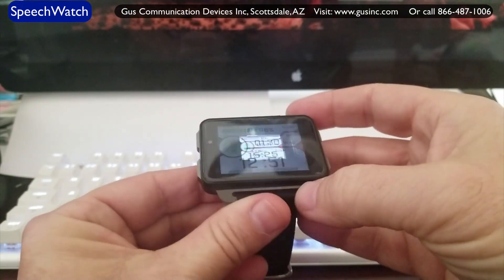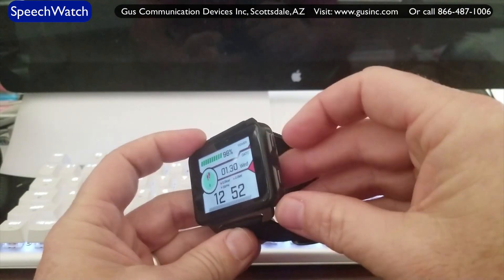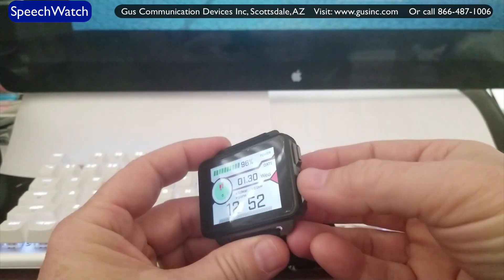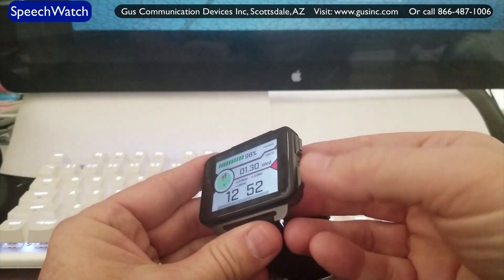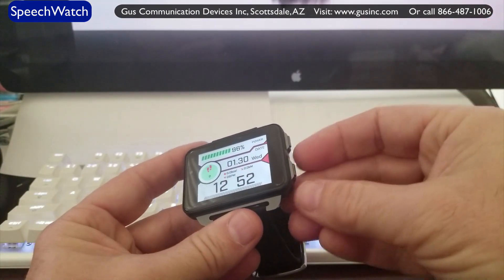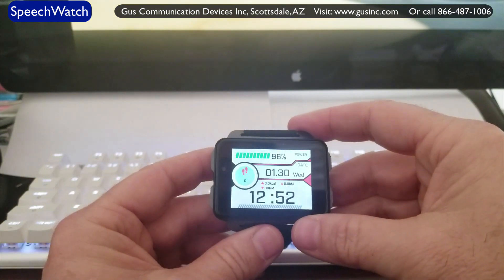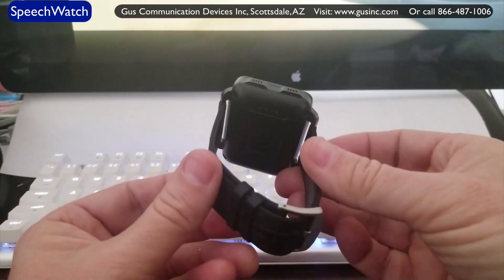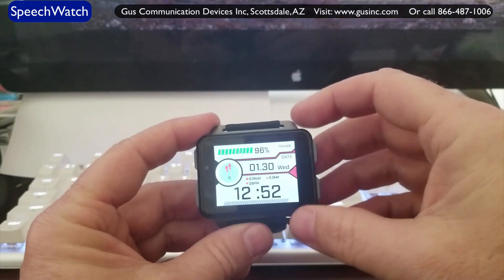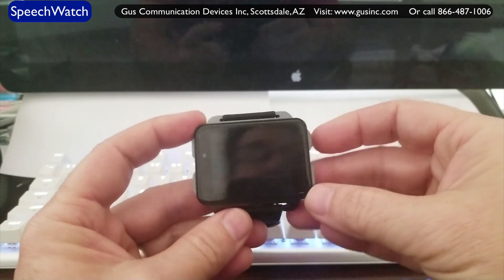Coming over to the right side of the watch, this button is your back button — like going back to the previous page or screen. This is your home button, like the home button on an iPad or Android tablet, which takes you back to your home screen. Here's your home screen. It's a 2.2-inch screen, but it's super functional as a speech device as well.